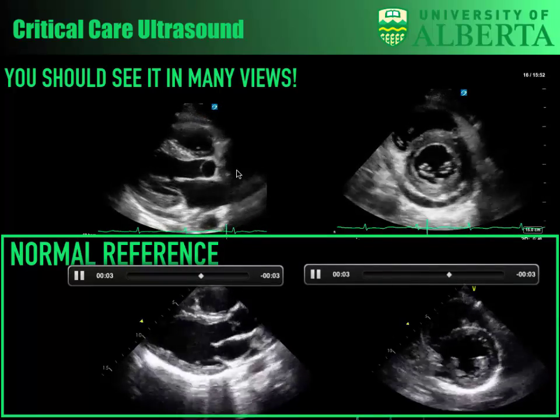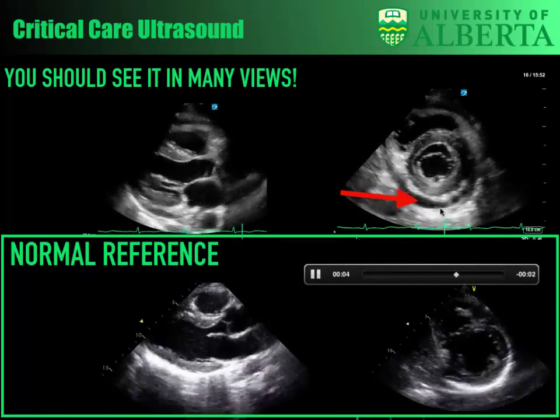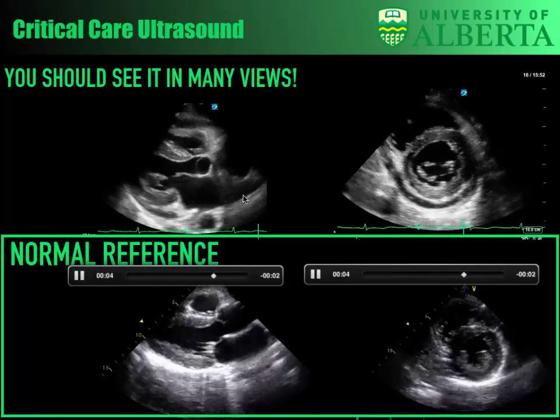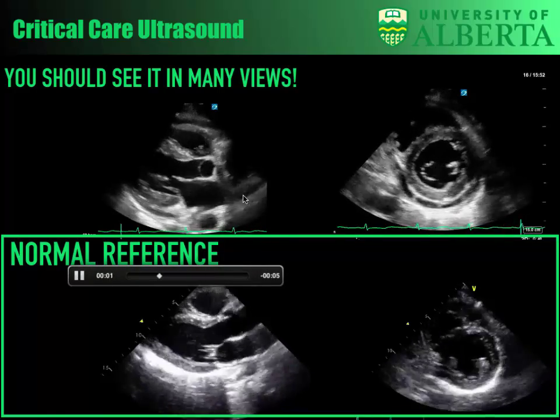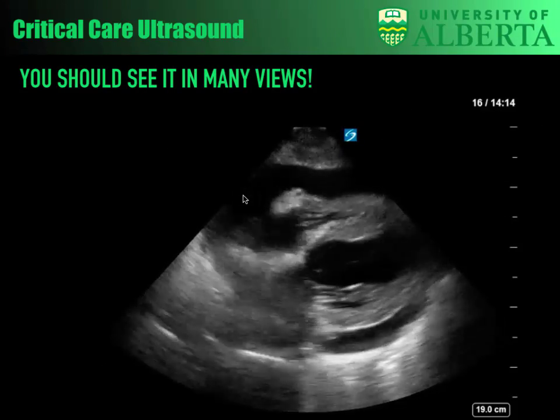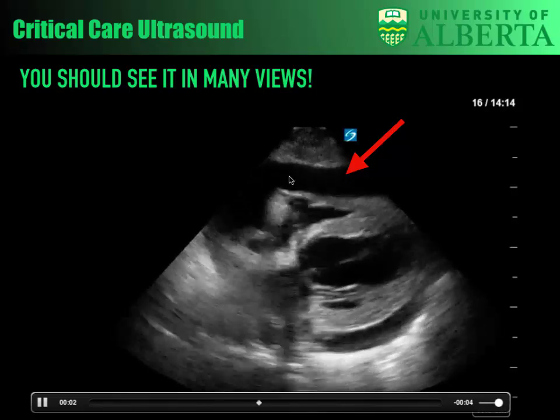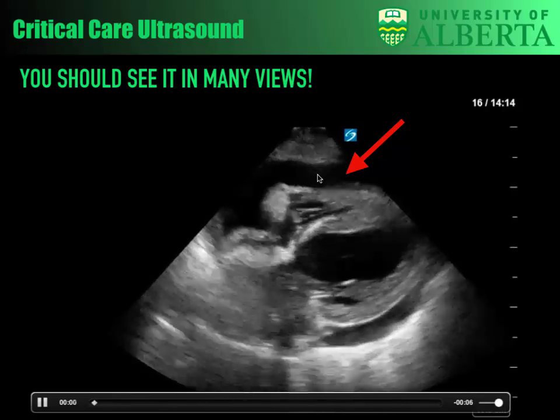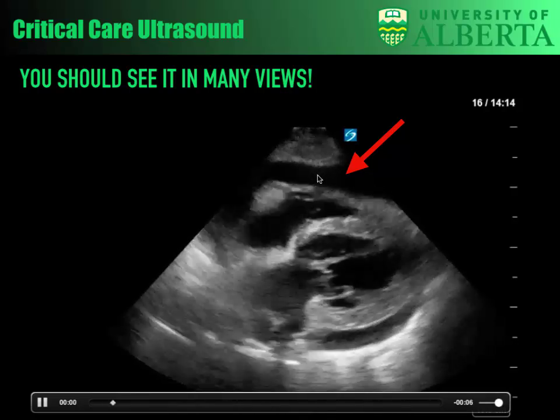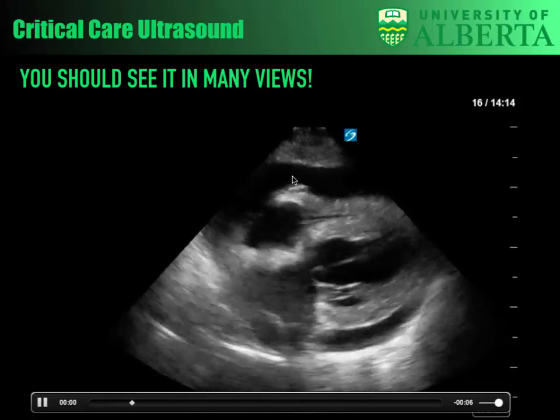Now if we turn the probe 90 degrees and get our short axis, we can see the anechoic space surrounding the left ventricle, and that further adds to our thoughts that this is likely pericardial. Again, you should see many views. That's true with any ultrasound-based artifact: you can mitigate artifacts by looking at other views. Here's a subcostal view of a patient who's quite sick and has a large anechoic space surrounding the heart. A large anechoic space usually helps delineate the structures very well because of a property called acoustic enhancement, where the ultrasound waves can amplify signals when there's fluid separating probe and tissue.